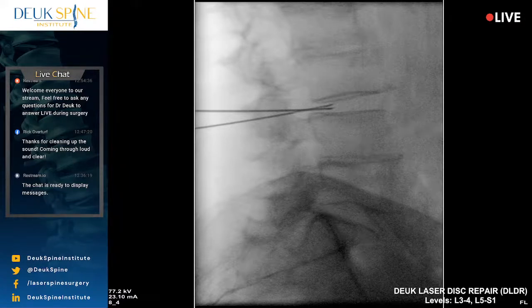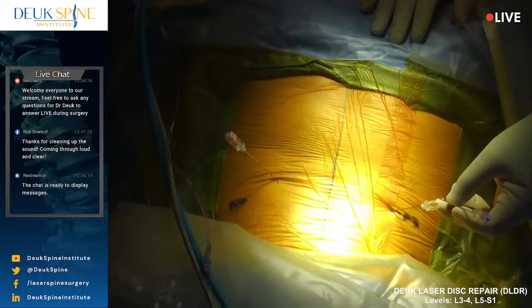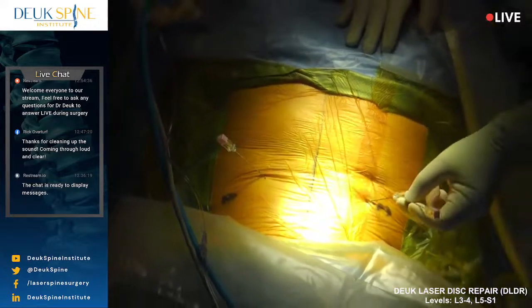We're not going to go there. No? There's no way 3, 4, and 5, 1 are the same entry point. All right, you doing okay? We've got 2 spots identified well, and we're going to do the third one now, okay? And then we'll be able to put you to sleep shortly thereafter. All right, just let me know if you're feeling any discomfort, okay? I gave you some numbing medicine, but sometimes I have to stop and give more.